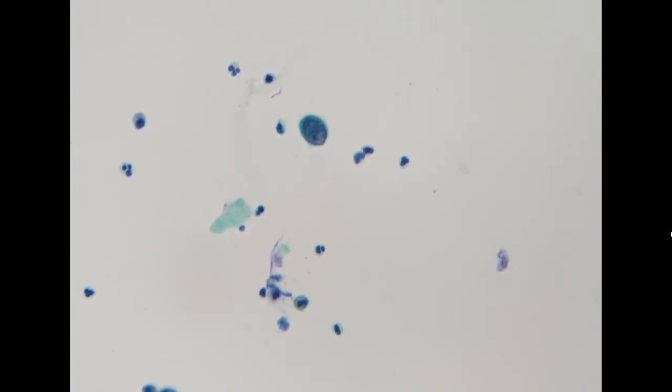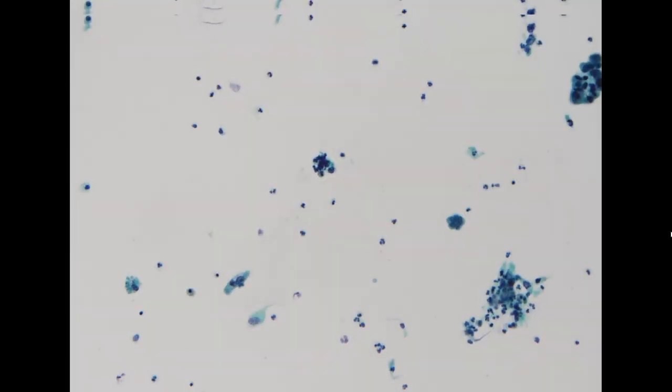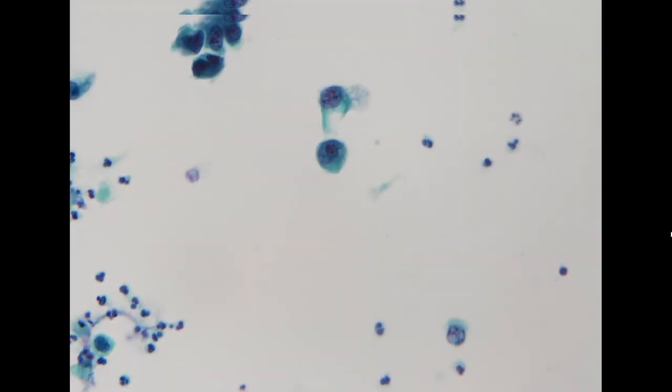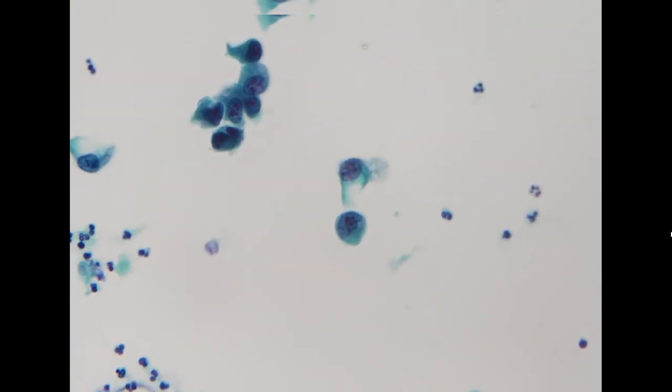For the urine cytology, it is important that we identify the individual cell with high-grade atypia. Sometimes the aggregates of cells can have changes that are indefinite, but it is important that we can identify all of these features in the individual cells. So these are positive for high-grade urothelial carcinoma.